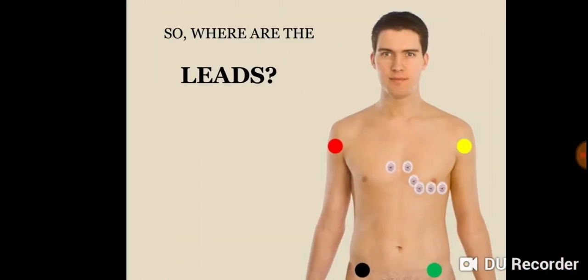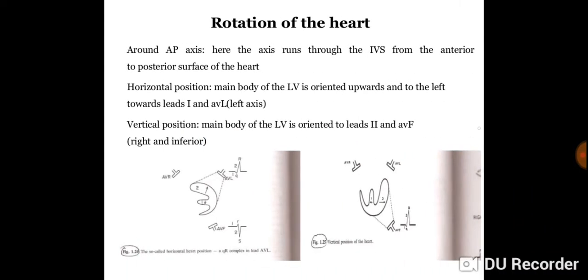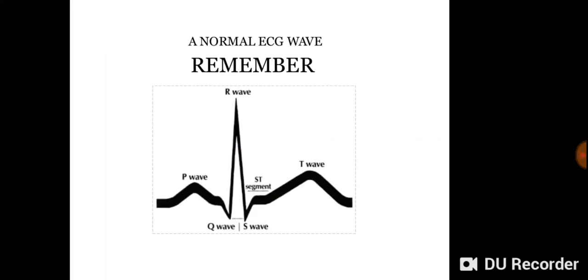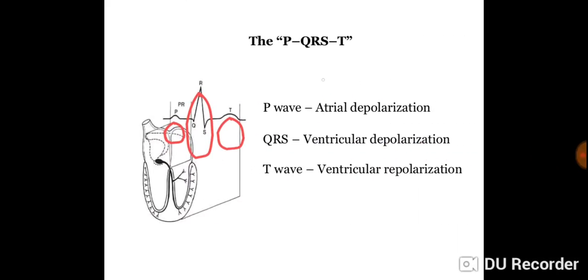Let's not get into how to do the ECG. It's not important for our examination questions. Let's just skip through them. Okay, first we need to know what the normal ECG is. It's right in front of your eyes, so let's get into it.